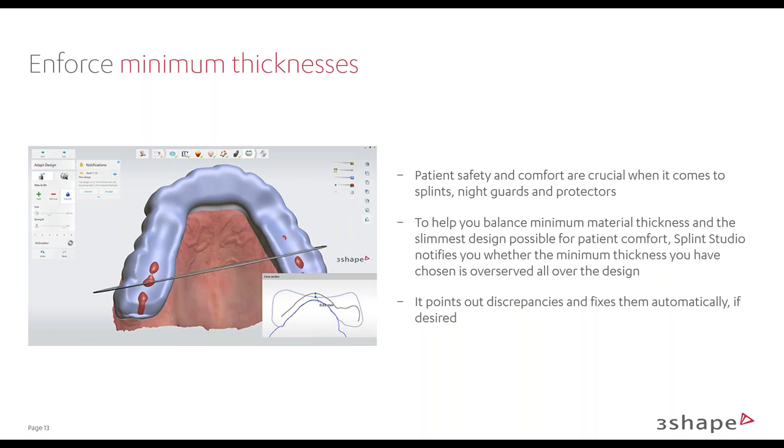There are some tools for enforcing minimum thicknesses. Within Splint Studio, you choose a manufacturing process and a material, and all parameters are set accordingly — similar to the crown and bridge side where you design within material parameters like zirconia. With splints, manufacturers need us to enforce minimum thicknesses. If one designs a splint too thin, you'll see it in red, and a notification will pop up asking if you'd like to enforce minimum thickness. We also have 2D slicing tools where you can draw a line through the splint and see what the thickness is.